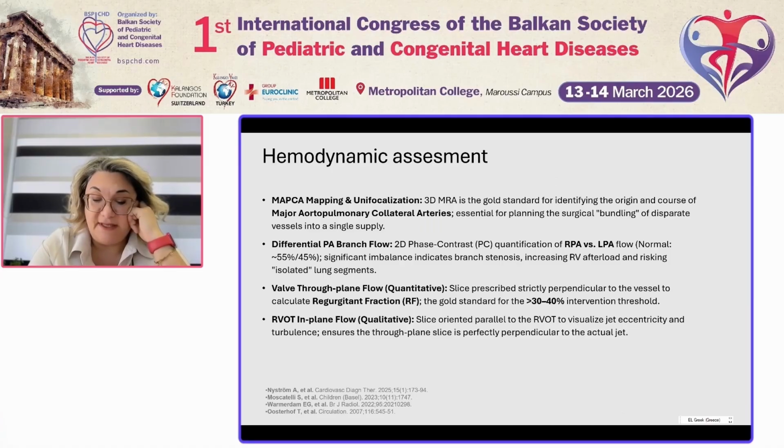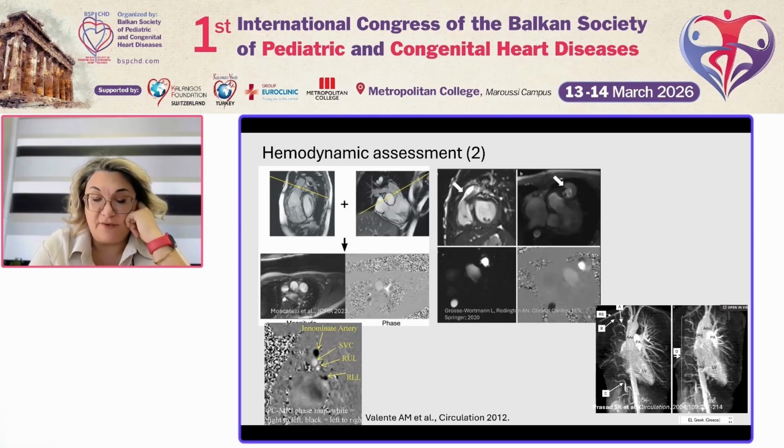The SSFP sequences define anatomy. Phase contrast imaging provides the hemodynamics and allows us to quantify the workload on the right ventricle. The workhorse sequence for flow assessment is phase contrast, and the commonest example is pulmonary regurgitation.